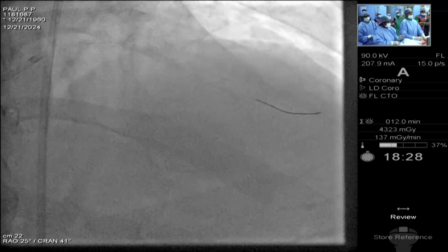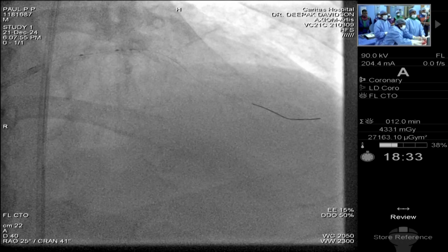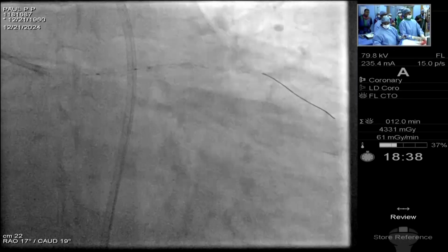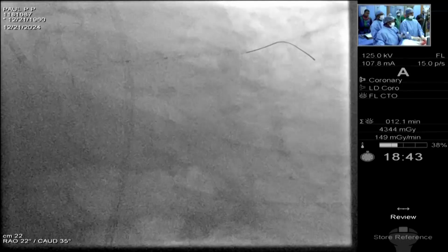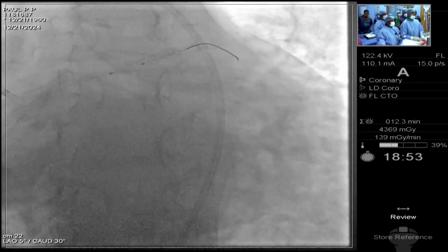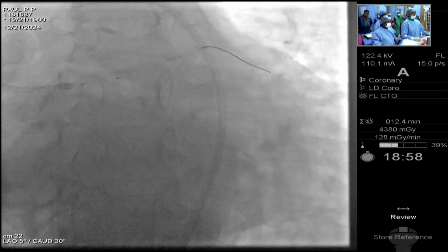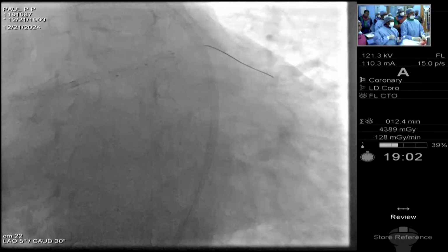It's exactly double that. Come caudal. More towards the left. Okay. Guide reposition. We push the guide. Okay. Small test.